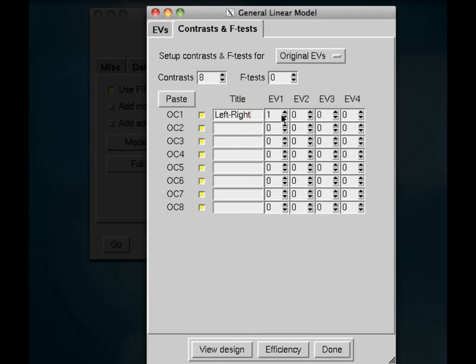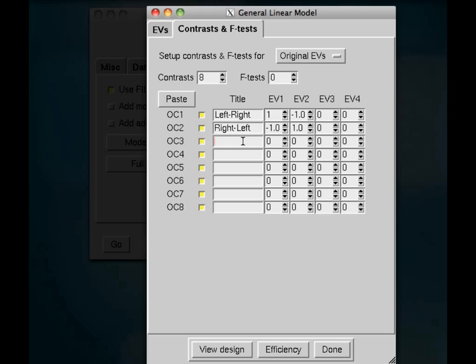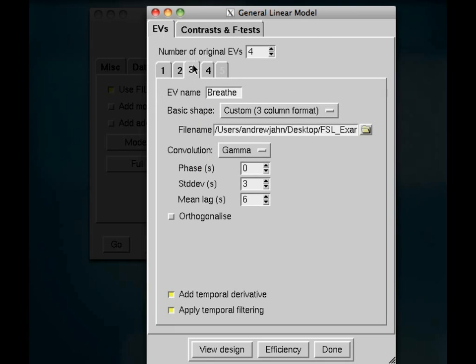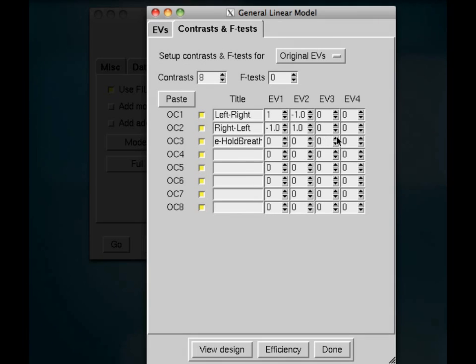And these other ones can be left at 0. So same thing, I might want to look at the opposite contrast, just to have all my bases covered, and I would assign the opposite weights. Now, let's see here with breathe minus hold breath. Breathe was 3, hold breath was 4. So breathe minus hold breath is going to be 1 in the EV3 column and negative 1 in the EV4 column. And same thing over here.